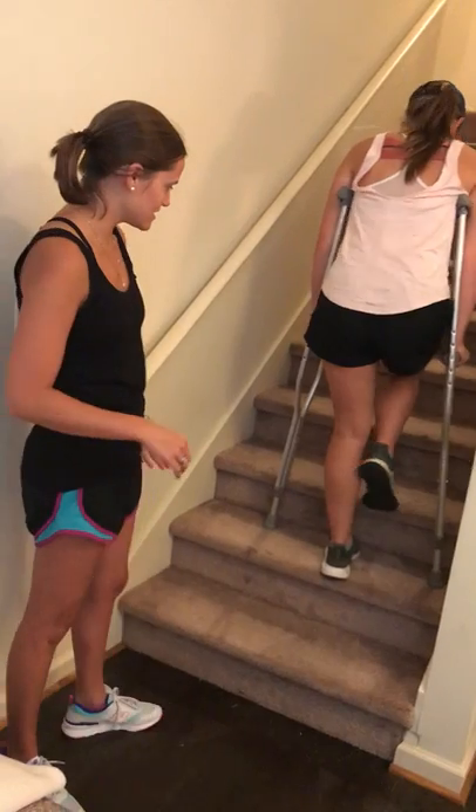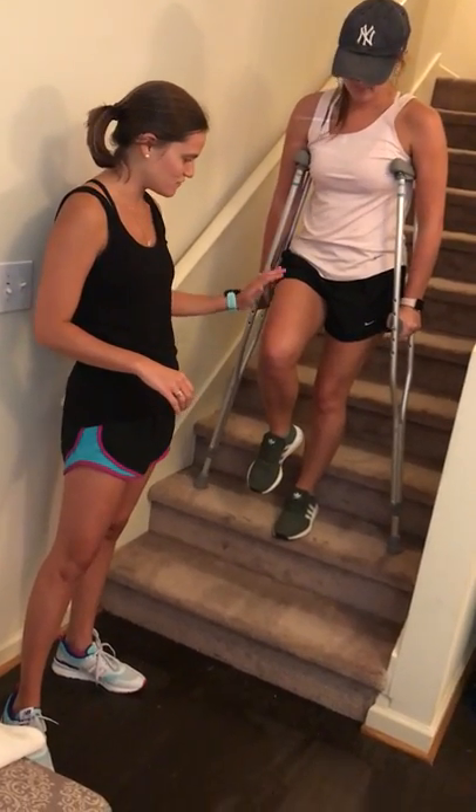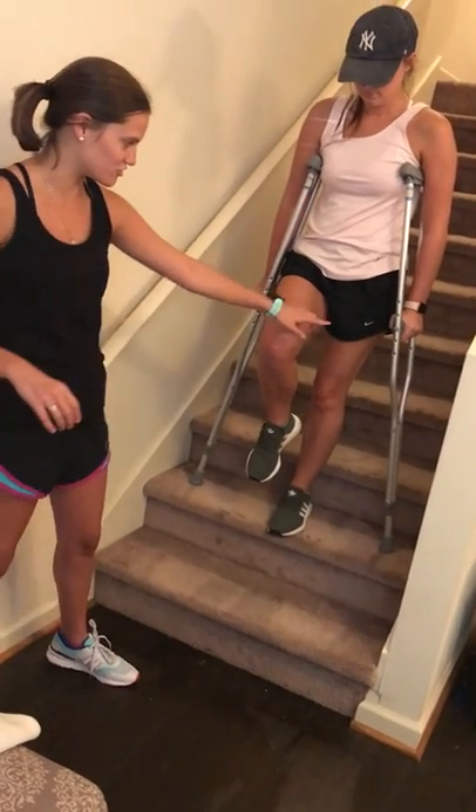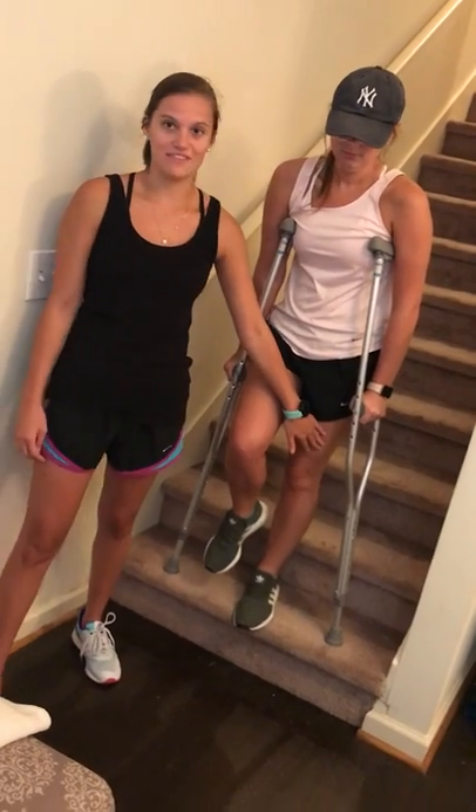To go down the stairs, you're going to move first with your affected injury leg and your crutches — go down, and then follow with your unaffected leg.